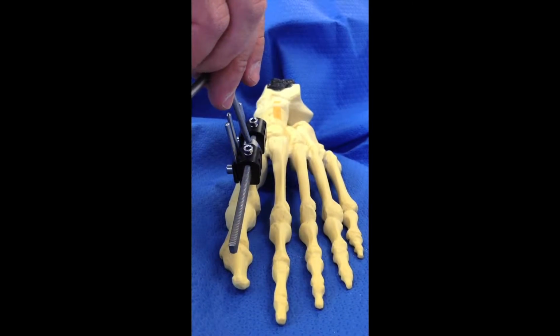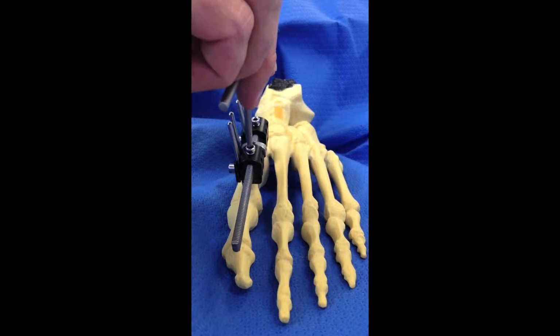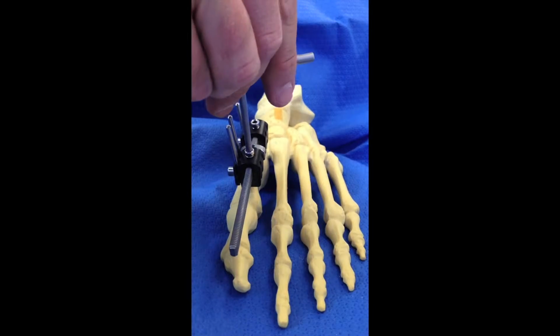Hi, I'm Dr. Austin Fragomen at the Hospital for Special Surgery. I'm here to speak to you today about the mini rail external fixator. This is used for metatarsal lengthenings, metatarsal bone transport, and metatarsal fusions. This is quite an effective device to really solve a lot of difficult metatarsal problems.